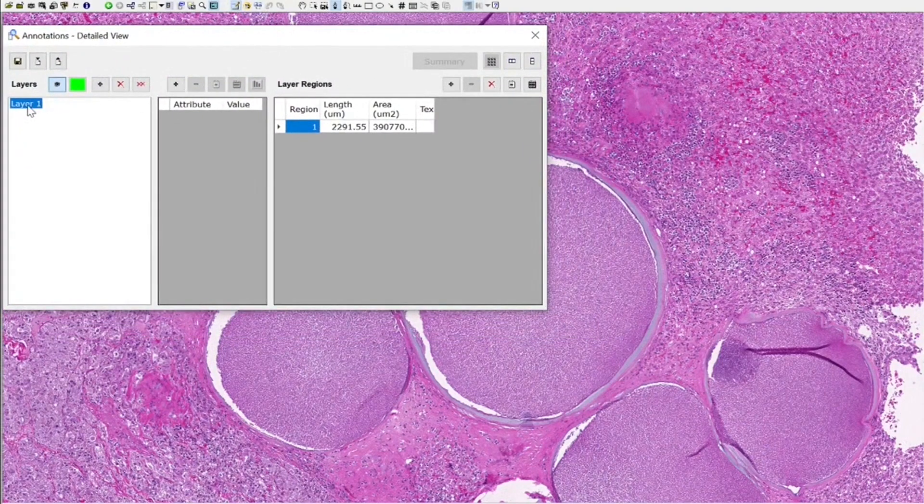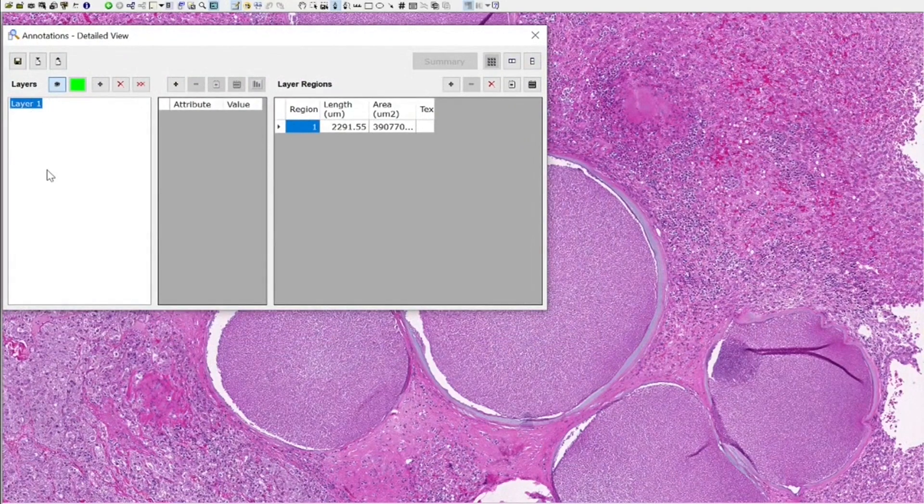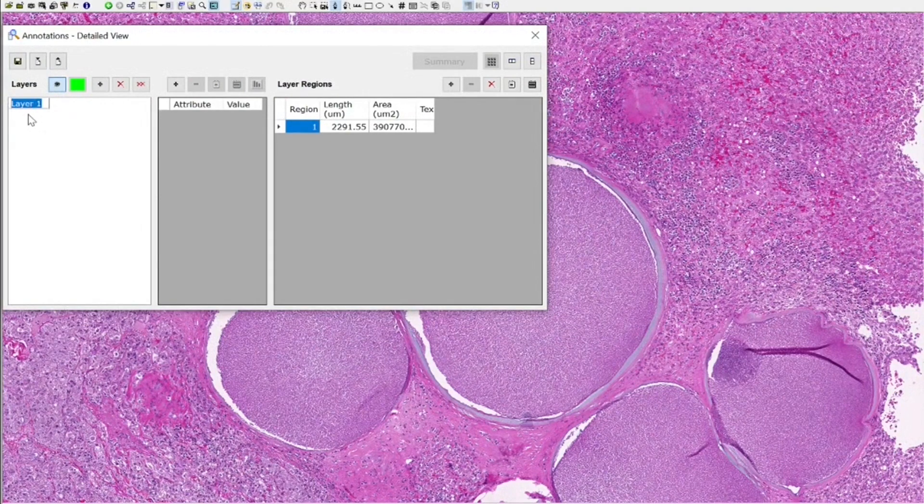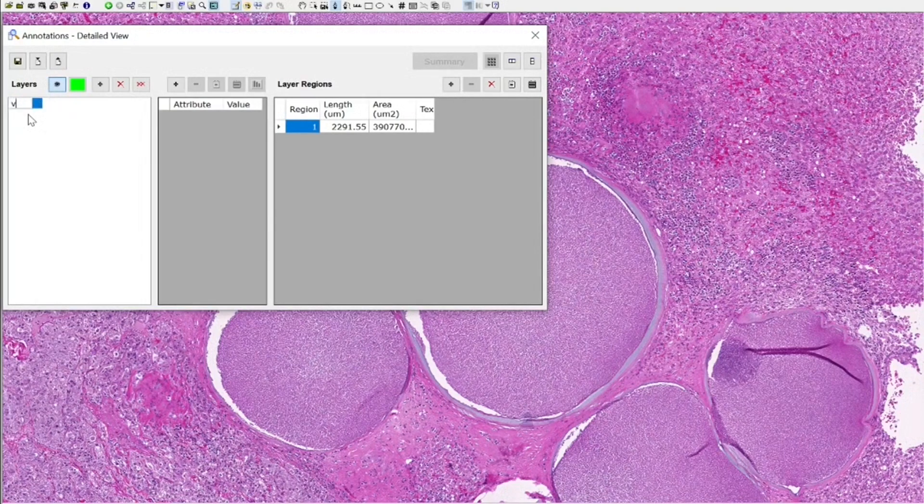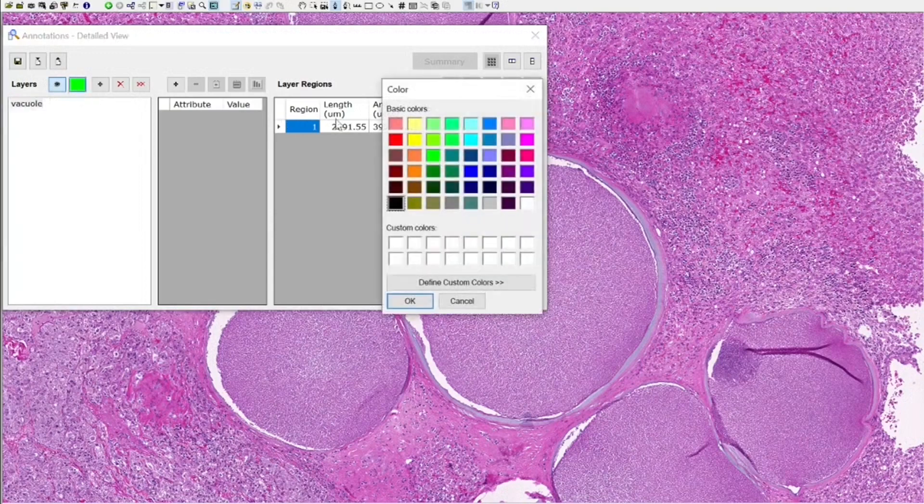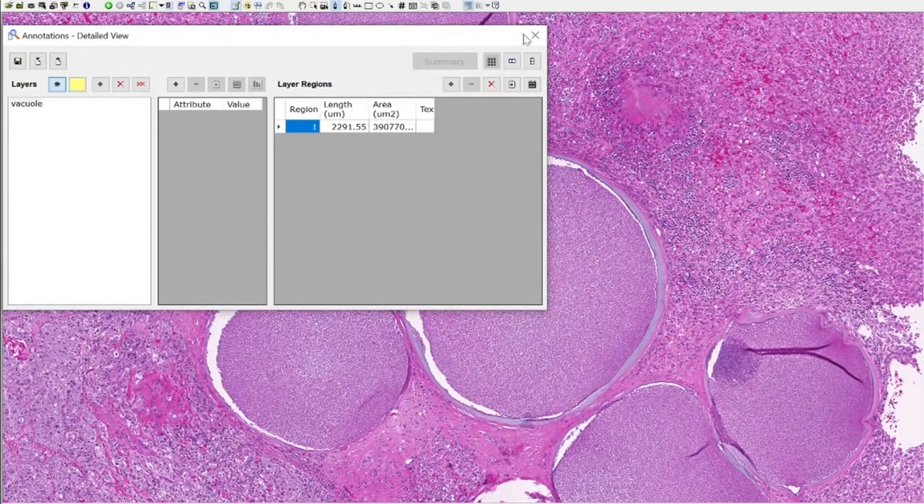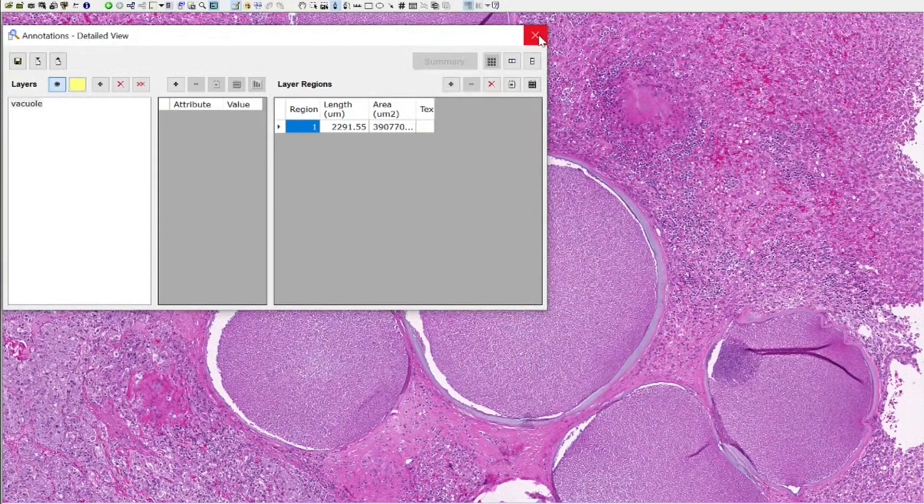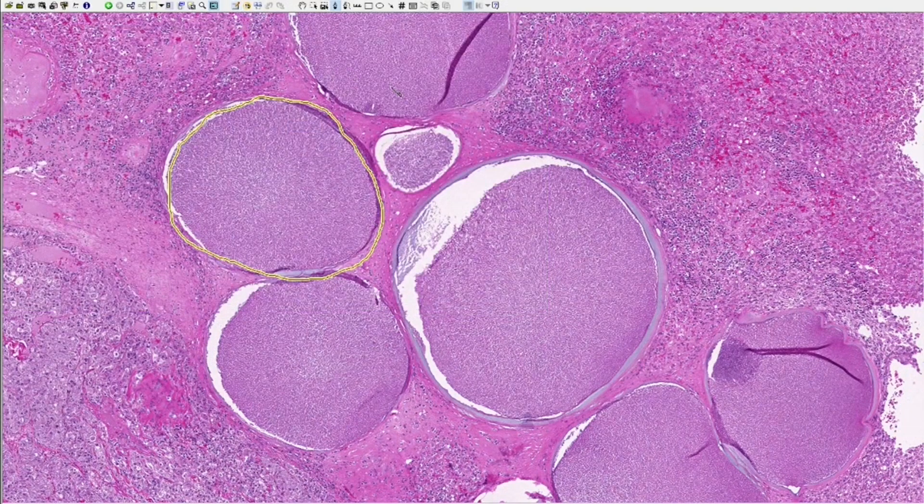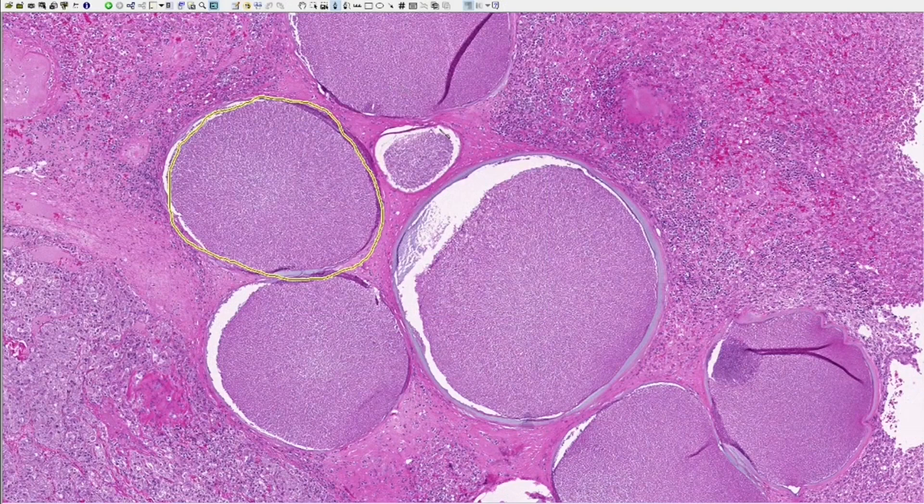You can see here that we annotated in layer one. We can change the name of this layer by double clicking on it or triple clicking. I want to call it vacuole and I want to change the color to, let's take yellow. When we exit this, we see that the color changed to yellow and now we can annotate in yellow.